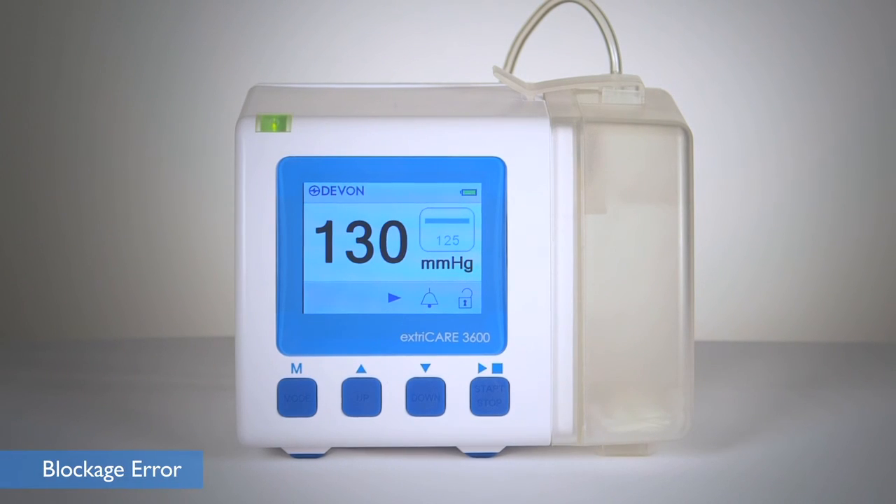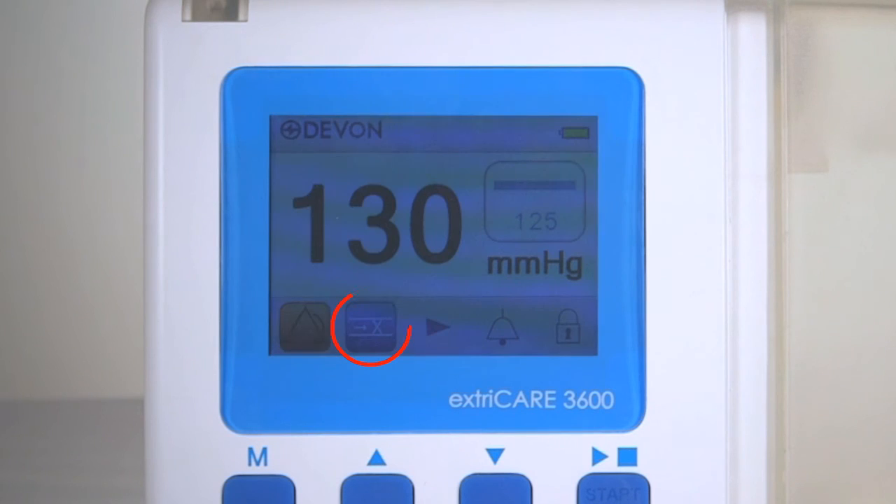If there is a blockage in the tubing or the dressing, the alarm will sound. The yellow LED will flash and the blockage error symbol will appear on screen. The pump will continue to run. Replace with a new dressing and tubing set to remove the blockage.